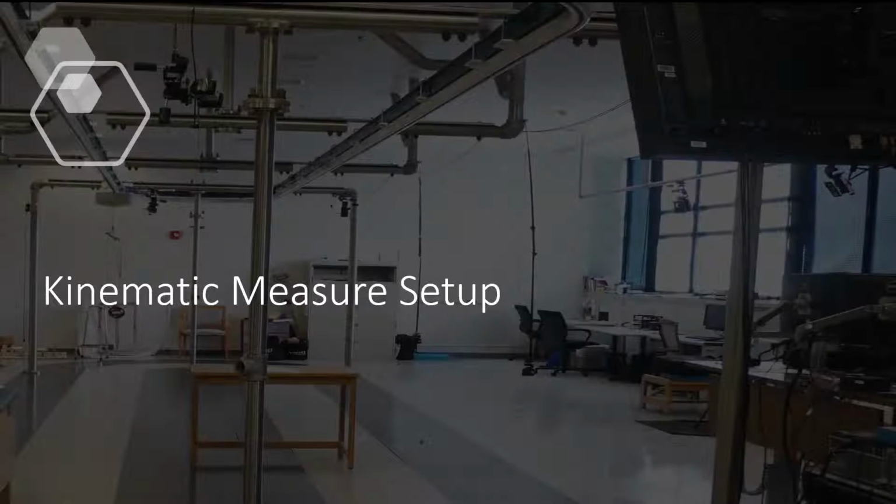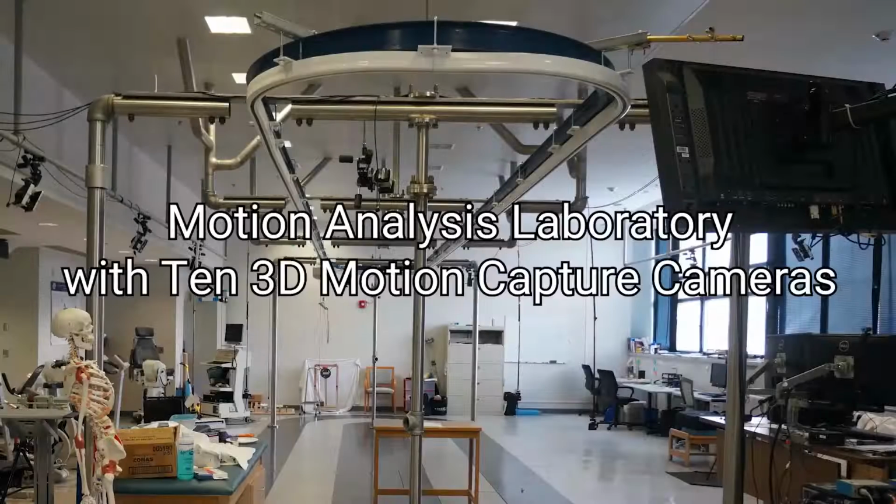In this section, we are going to explain the kinematic measurement setup. We use 10 Vicon 3-dimensional motion capture cameras with motion monitor software to record goal-directed arm-reaching kinematics.